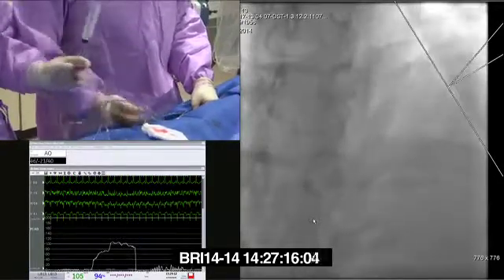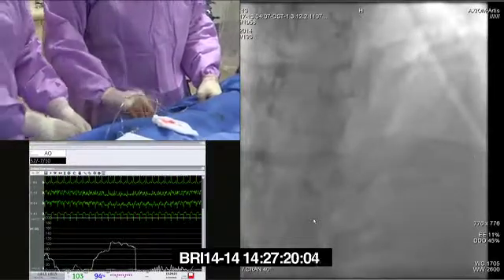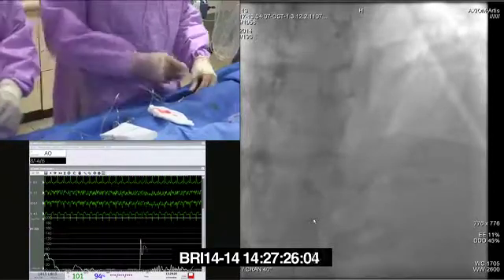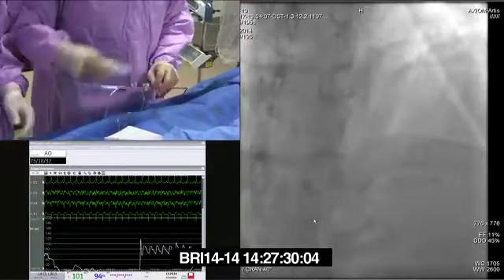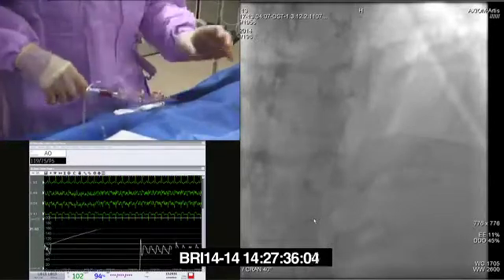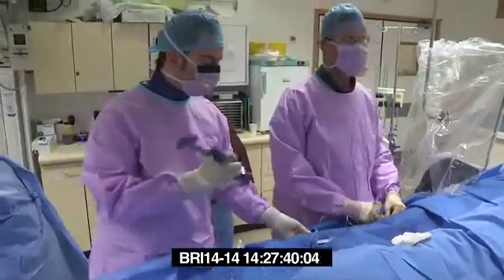Okay, let's just take a 1.5 balloon, please. There will be a lot of thrombus associated with this. Just 12 will be fine, and then we'll just re-prep the export again, please. Obviously, having used the export, I'm just going to let this all bleed back, make sure there's no air in the system. Get a Venturi effect. That's great, thanks.